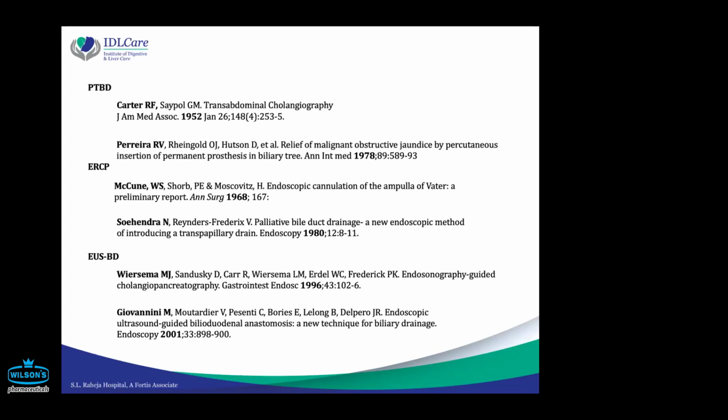Now, EUS-BD arrived at the scene when two techniques were already there, PTBD and ERCP. So, few enthusiasts tried EUS-BD, and the natural place to try for gastroenterologists was where ERCP was not possible, where duodenal stenosis was there, or it was difficult to cannulate, or post-operative anatomy. So, Wiersema first showed us that via the EUS scope, we can obtain cholangiograms, and you all know Mark Giovannini. He did the first EUS guided biliary drainage in 2001.